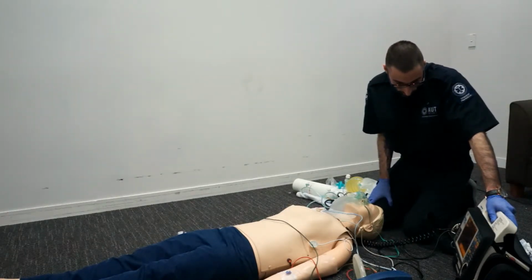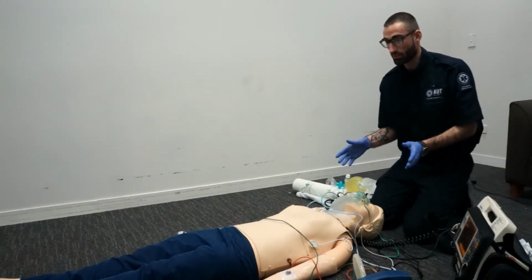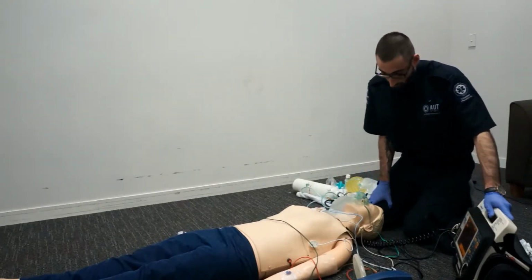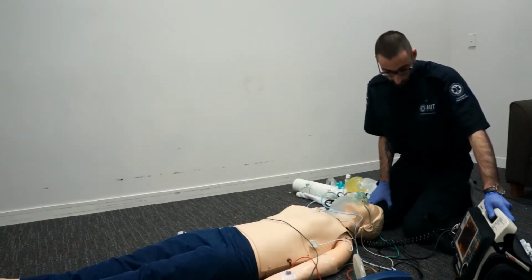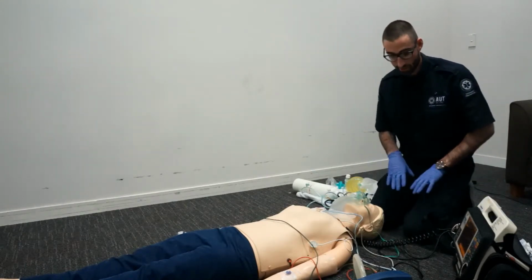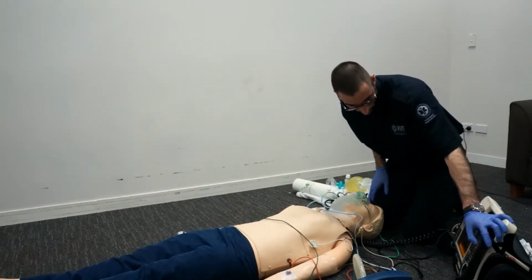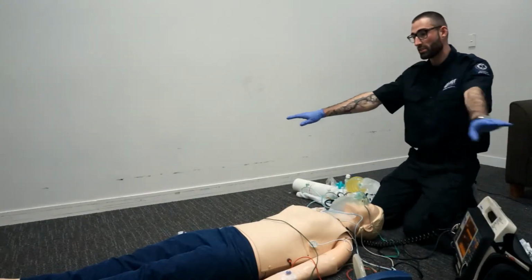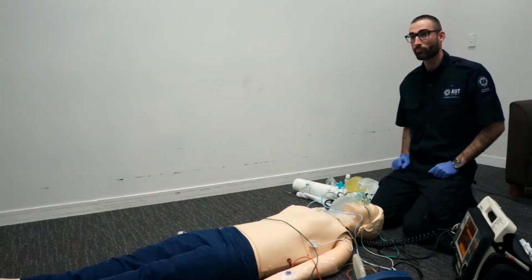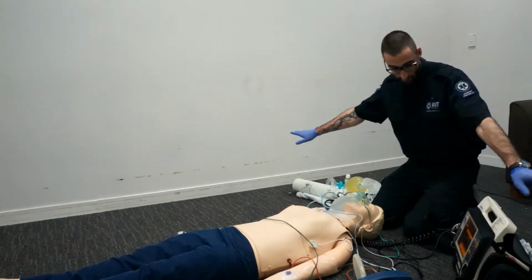Ensure the patient has received adequate sedation if indicated. In this situation, sedation is not indicated as he is unable to obey commands. Select the joules, charge the defibrillator, and confirm everyone is clear. Okay, so we've got our max joules at 360. I'm going to go ahead and charge. Everybody please stay clear of the patient. Press and hold the shock button until the shock is delivered. Okay. Everybody please stay clear.